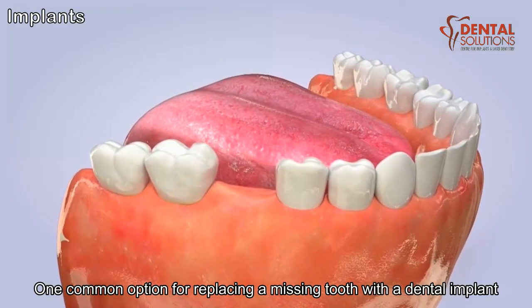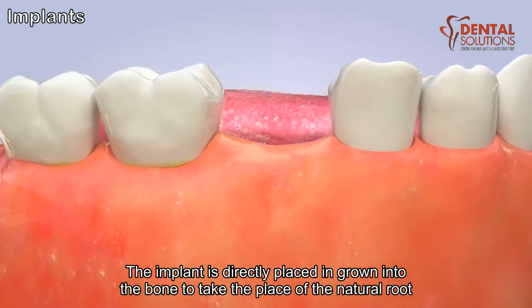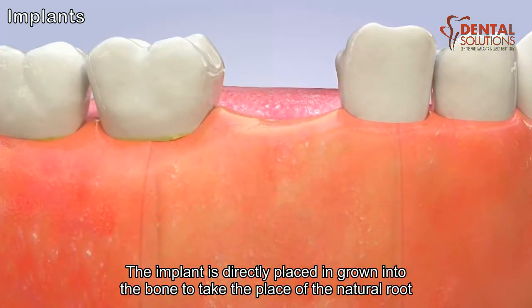One common option for replacing a missing tooth is with a dental implant. The implant is directly placed and grown into the bone to take the place of the natural root.